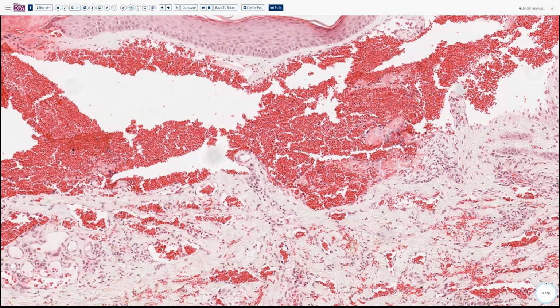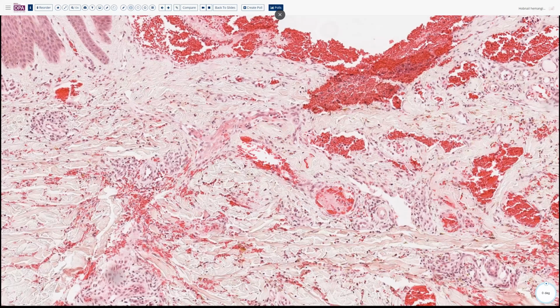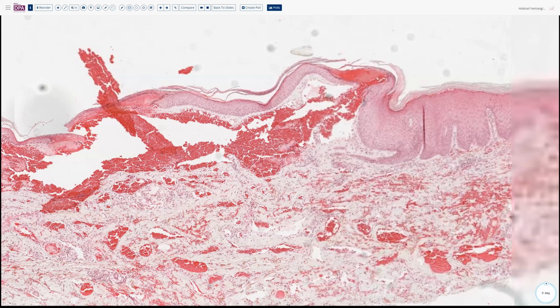Now, there's a few, and it's kind of a stretch in some of these areas. I recognize that. This is a hard entity to find very many good examples of. Sometimes these cells that are sticking up into the lumen can also be likened to matchsticks, sort of like a little bit of a bulb on the end as it sticks up into the luminal area. And obviously, you may have to hunt a bit to do that. So I'll put out a challenge there.